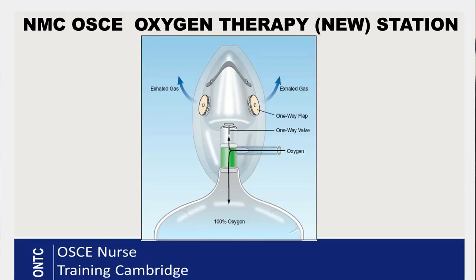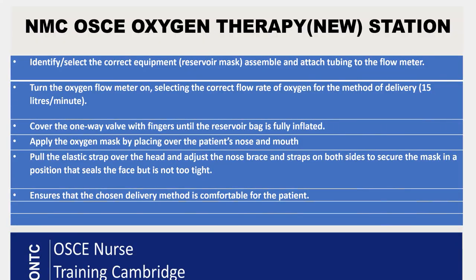The reservoir mask has a reservoir bag where oxygen collects before the patient inhales. You need to make sure it is fully inflated first. To inflate the bag, place your finger on the T-shaped valve on the inside of the mask — with the flow meter already running, the bag will start filling with oxygen. Make sure it is completely full and fully inflated before applying it to the patient.